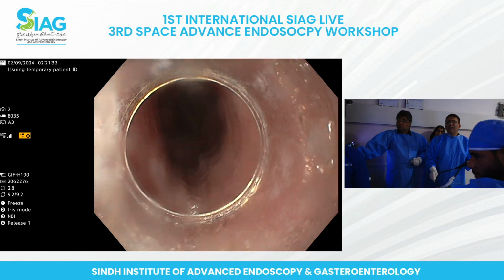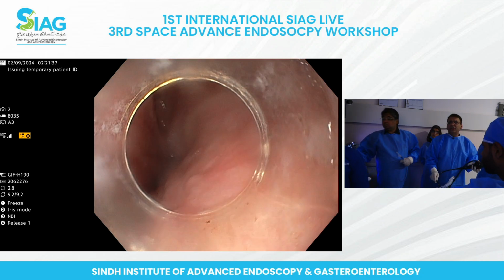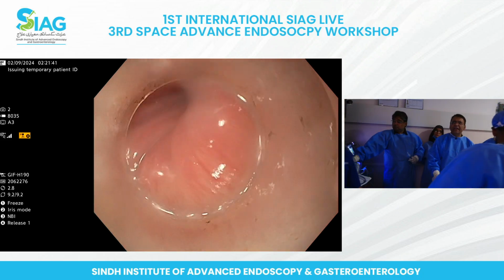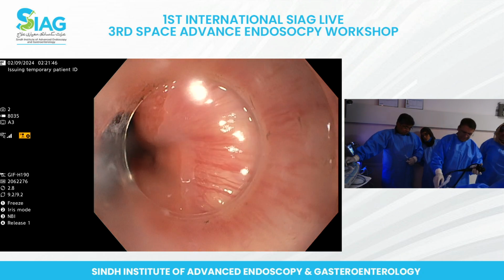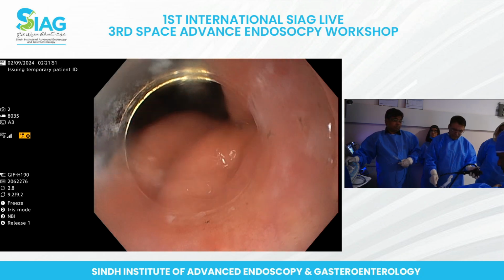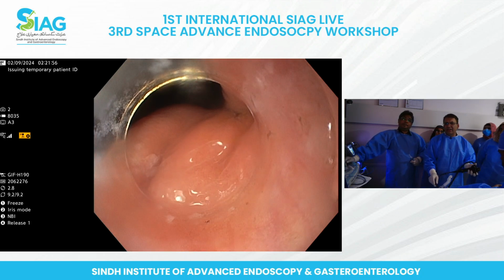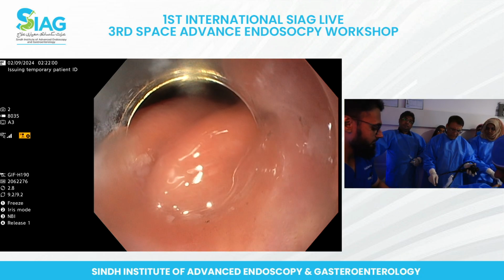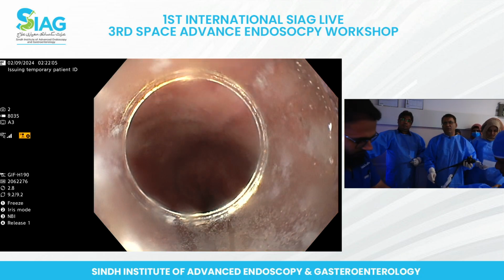So here, the esophagus is quite dilated actually. I did not expect it to be that dilated the way I was told, but it is quite dilated. And his GE junction is at 48, 49. So I think I'm going to do an 8 centimeter tunnel in this. For that, if I consider it 49, then we'll start at 41, 42.